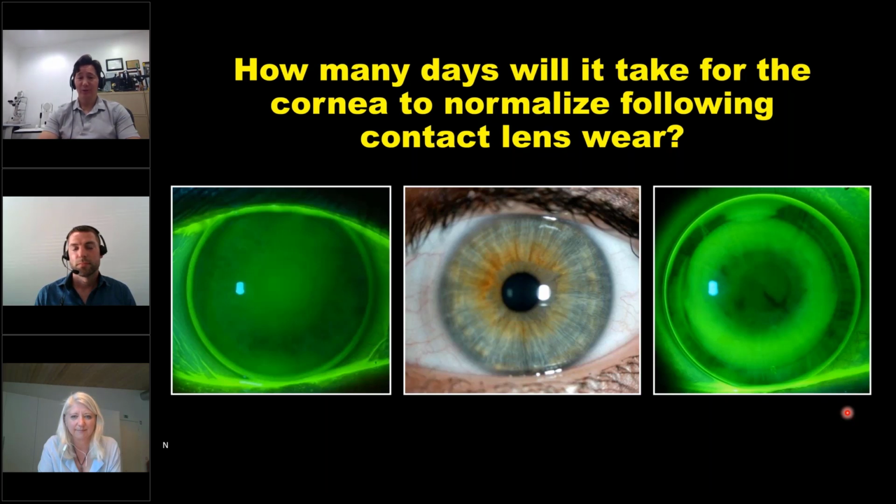We get a lot of Asian patients, and they may come in having worn Ortho-K lenses, but we have no data at all on their lens. We don't have any history. We don't know what to do. If they need a new lens, we don't know how to modify what they have. So how do we address this when we don't have any topography and we know the cornea is molded?